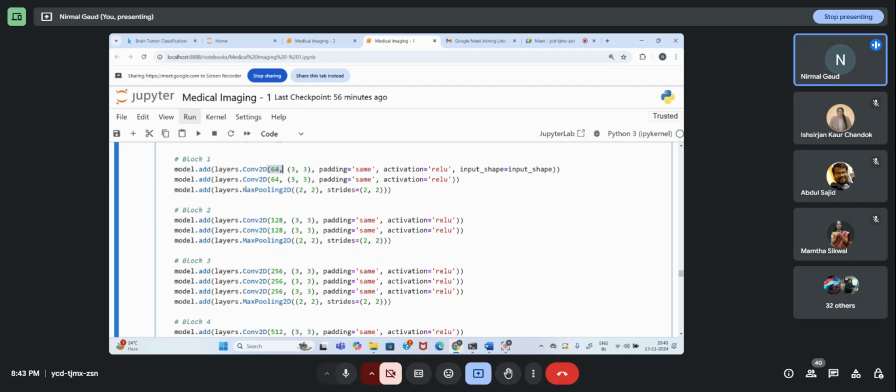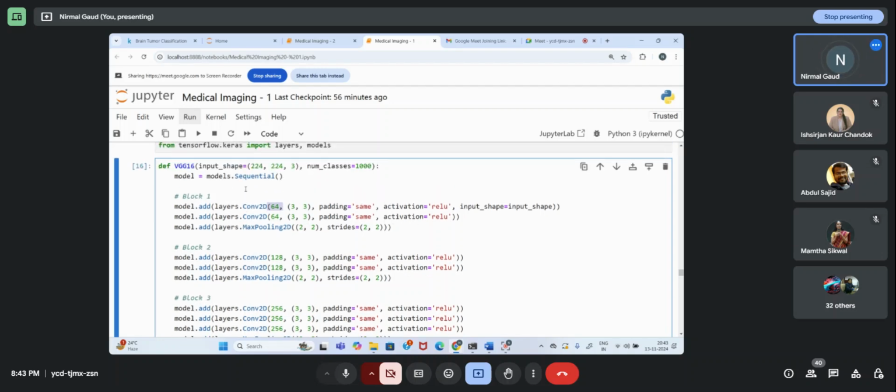And the shape of the image will obviously be reduced. You know the formula for how the reduction goes on. Again, I will show you in my template.